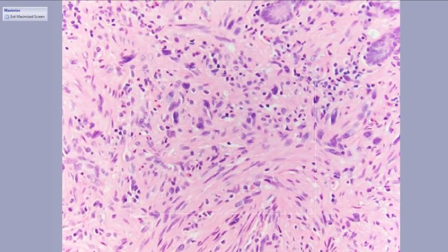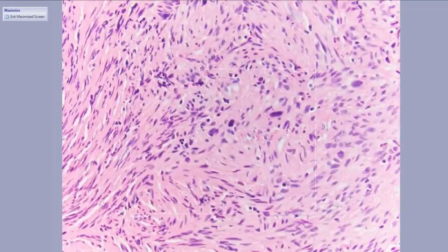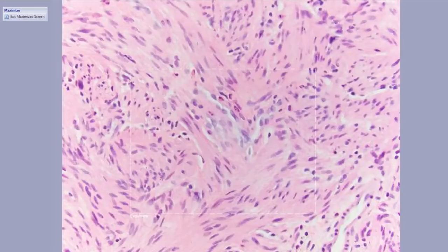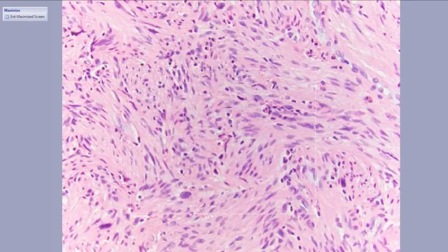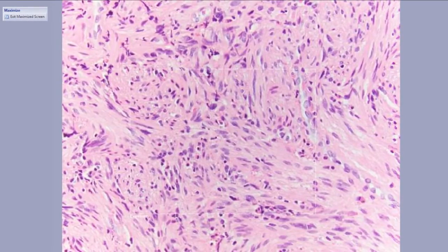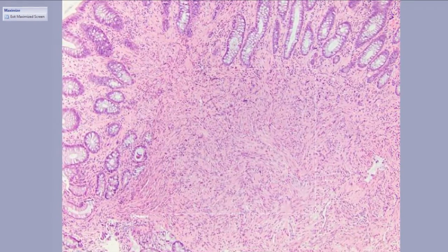It kind of looks a little bit like that schwannoma, and then you've got focal atypia. The cells are enlarged, with funny shaped, hyperchromatic nuclei, but there's no necrosis, no mitoses in this example. The largest series that exists of GI tract leiomyomas encountered 2 of these with nuclear atypia.